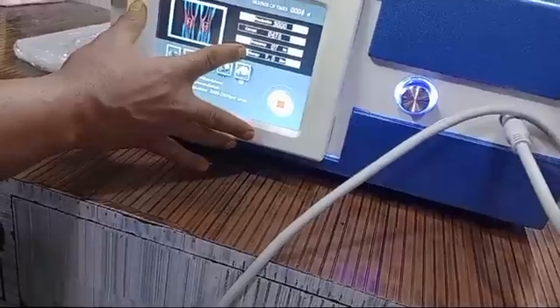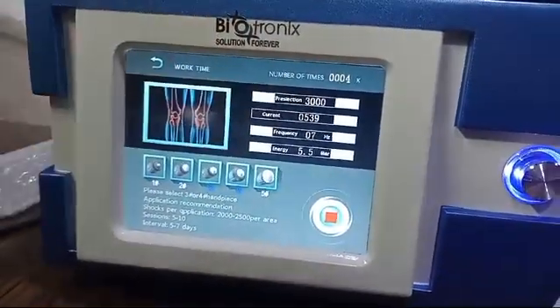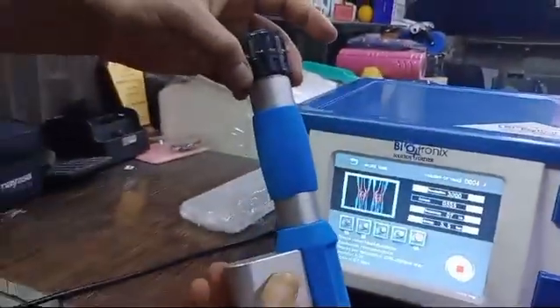It's counting the shots, currently 504. You can see the shots will go up to 3000 for this area. If I press here, it will be switched off.